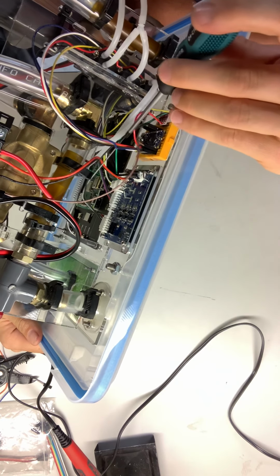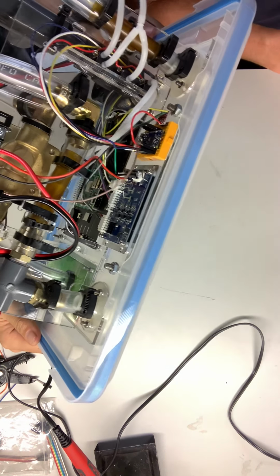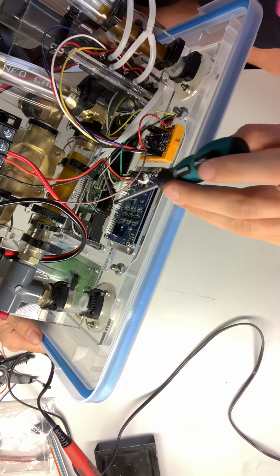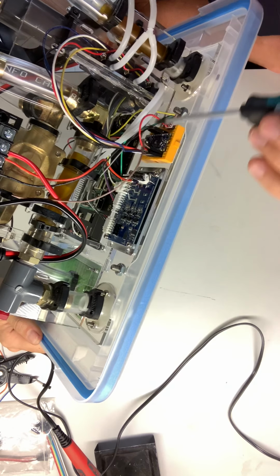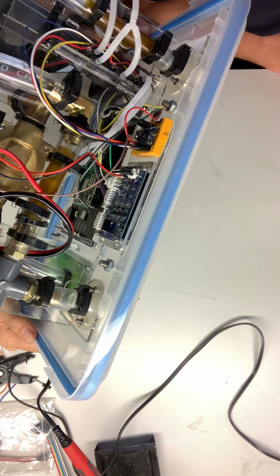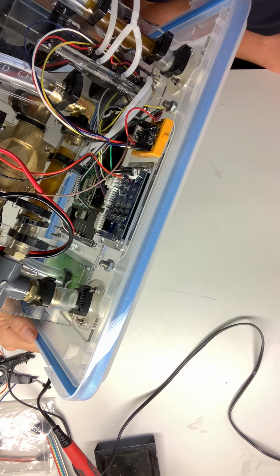And then gray is next to that, which is 7. And gray is the motor driver. Yep, so the speed signal to the motor driver. And then coming back from that, we have a ground back to our Arduino, which is in the same ground as the level shifter. Yep. That's our best ground point.